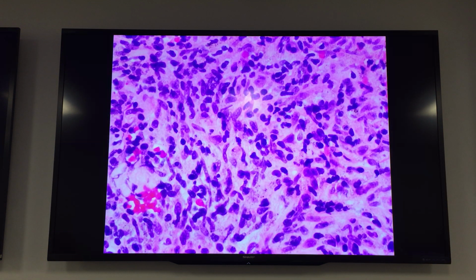Let's give you another. This is a little tougher. Let's try one of the third years. Anyone? What are you seeing here, guys? Are there second and fourth years here too? No, third year. Okay. Anyone? Granulomatous inflammation. Yeah, it's kind of vaguely granulomatous, isn't it? That's a very good eye actually, because it's not well formed. It's kind of loose, so it's good.